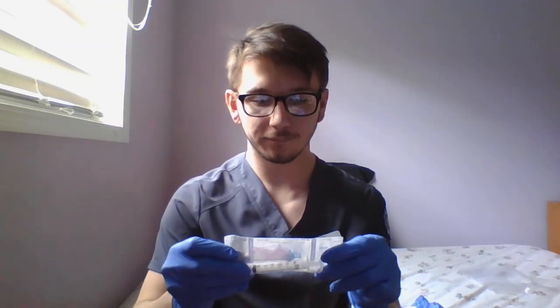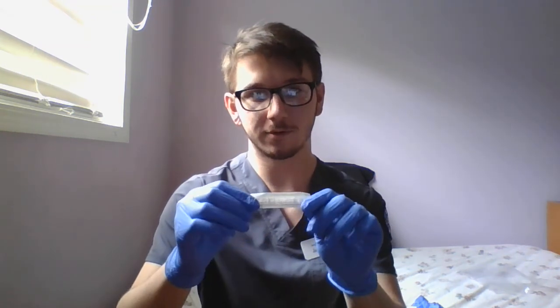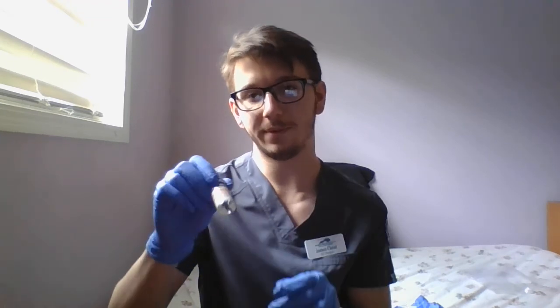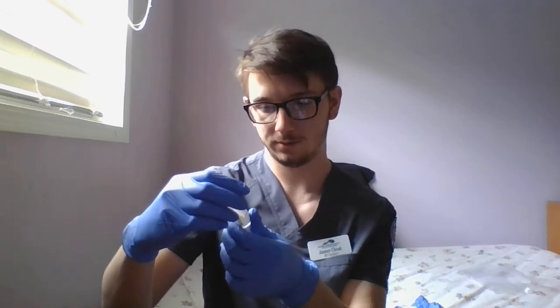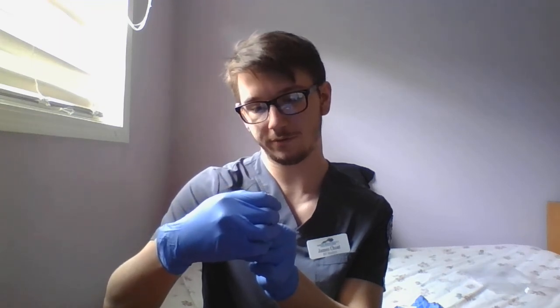And before I even begin, I'm going to make sure I have the right needle. This is 3 milliliters. It's 23 gauge by 1 inch, which is the appropriate range for an IM injection. Also have a blunt tip cannula here. And then my medication, I'll be using 1.5 milliliters of Demerol today. And then I'm going to check the expiration date, which is 02/28. So we're good there. And then I have the pad.